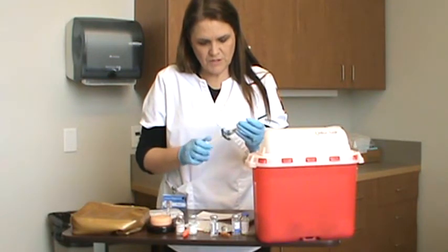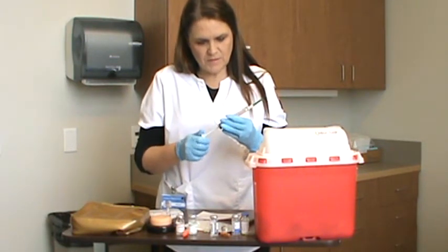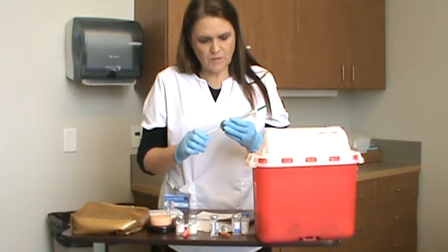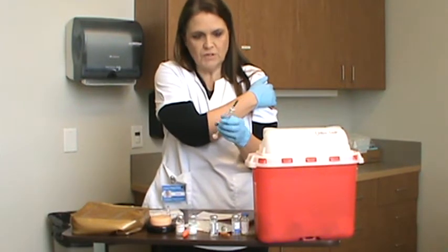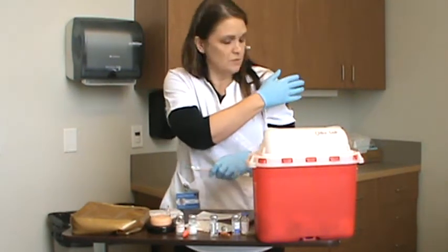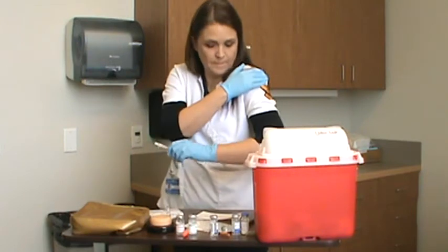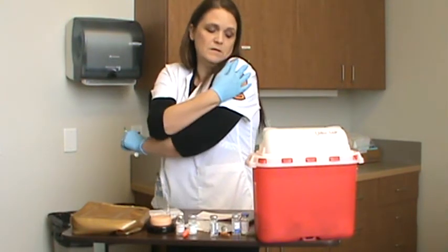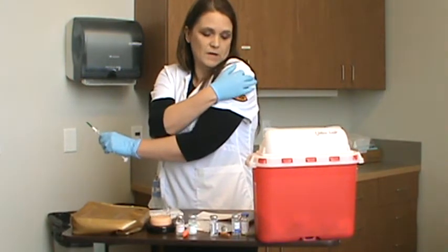For IM injections, there are 3 sites that you can use. You can use the deltoid, but you don't want to give a shot that's more than 1 mil. And to find that, you would go 2 to 3 fingers down from the acromion process, and then make a V, and you would give the shot right in there.